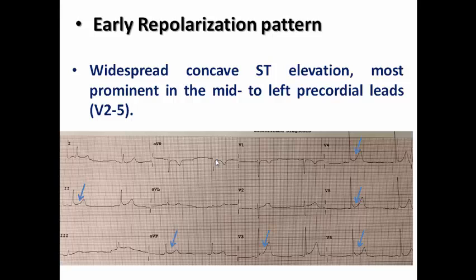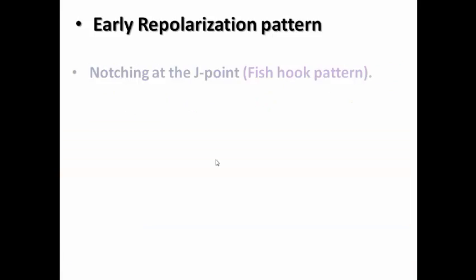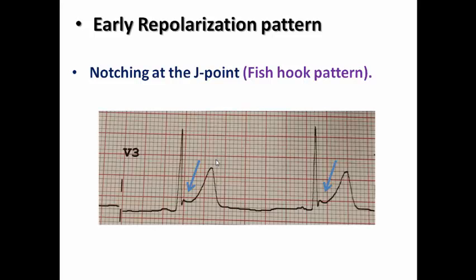In this ECG, we can see widespread ST elevation from V3 to V6, also involving slightly lead II, AVF, and lead I — so the ST elevation extends to inferior and slightly to lateral leads. The second criterion is notching at the J-point, sometimes called the fish-hook pattern in the literature. Here we can see the J-point is notched, not a smooth transition from the QRS complex to the ST segment as seen in STEMI. Whenever you see this characteristic criterion, it helps distinguish early repolarization pattern.